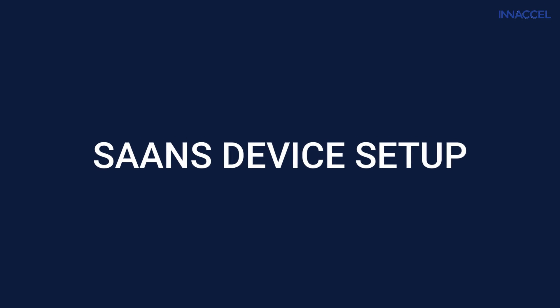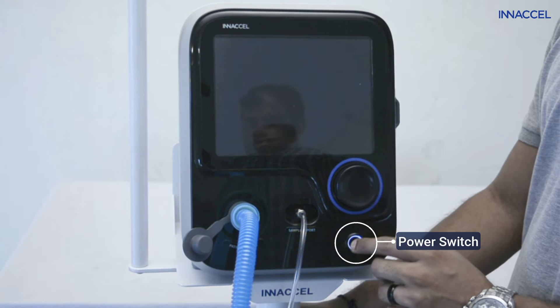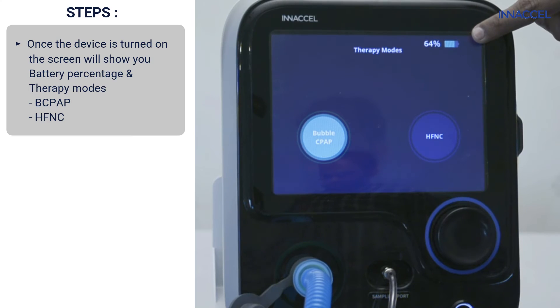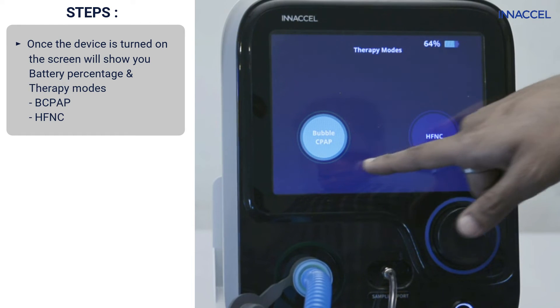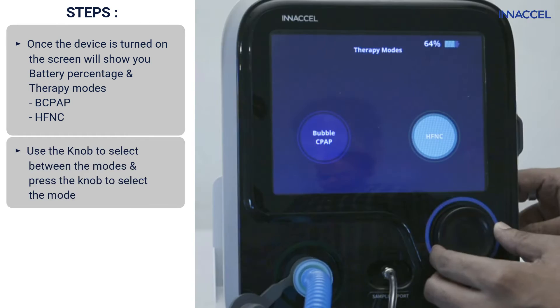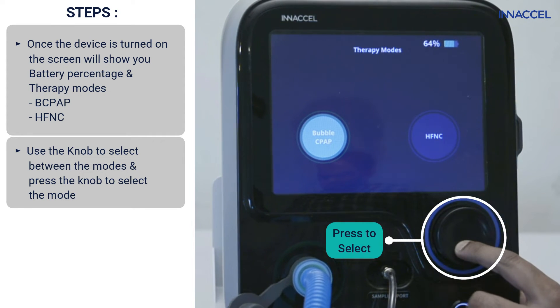SAS device setup: switch on the device by gently pushing the power button. Once switched on, you will see the battery level and available mode. Make sure the device is plugged in if the battery is below 30%. Use the knob to move to the bubble CPAP mode and gently press it to select.